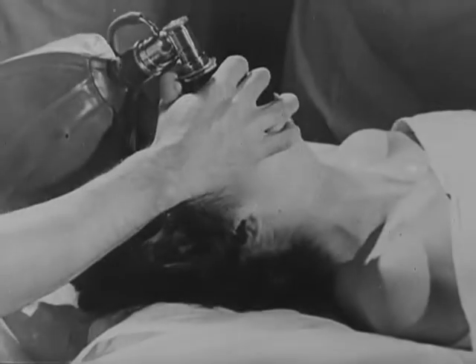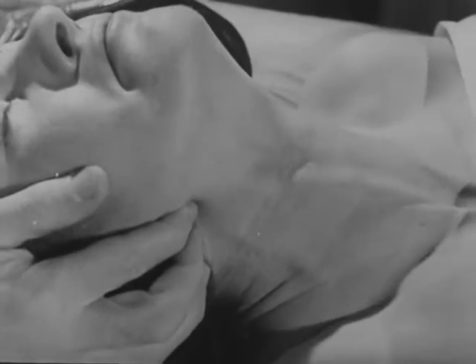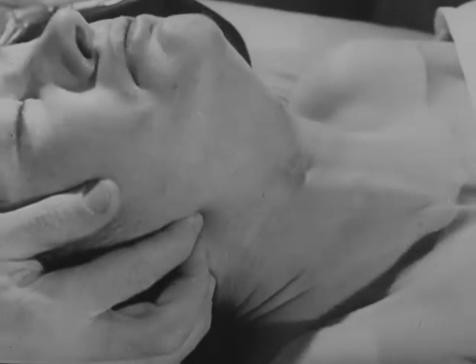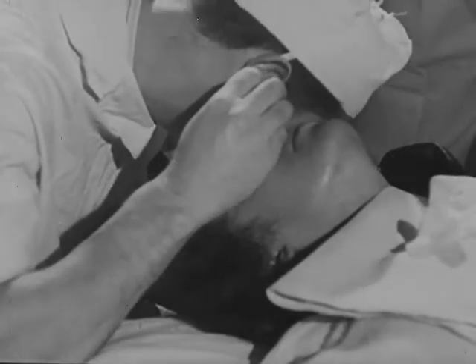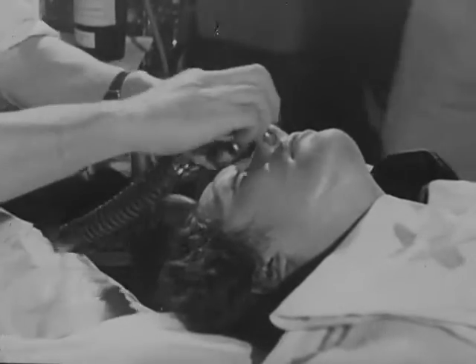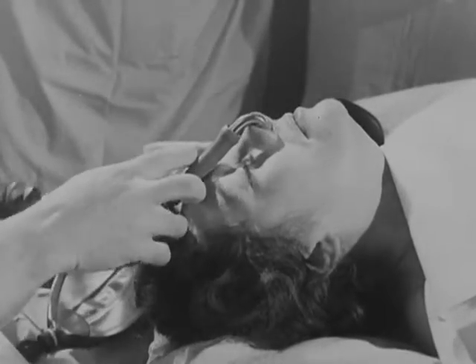Without a free airway, the administration of a general anesthetic is impossible. Obstruction may arise at any part of the air passages, but the greatest danger and the most difficult to deal with is when obstruction occurs at the larynx itself. The popularity of endotracheal anesthesia is therefore easy to understand, because its fundamental principle is absolute airway control by intubation of the larynx. Once this control is secured, the difficulties and risks of respiratory obstruction no longer arise.